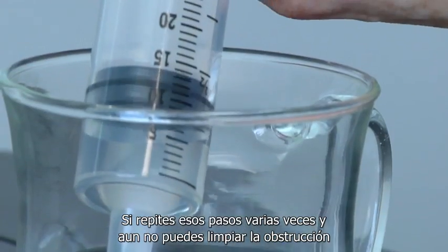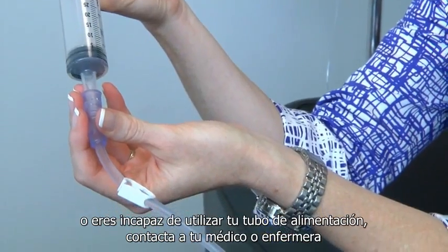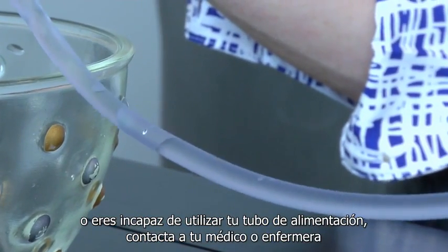If you repeat those steps a few times and you still can't clear the clog, or if you're unable to use your feeding tube, contact your doctor or nurse.